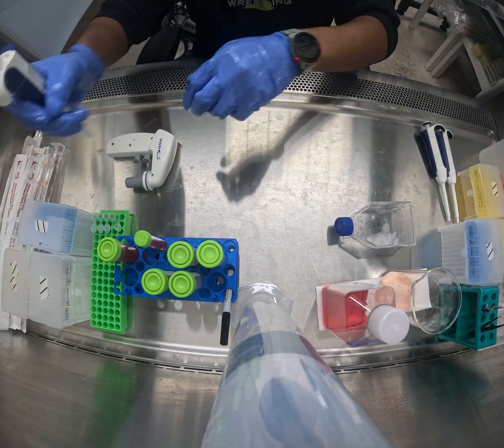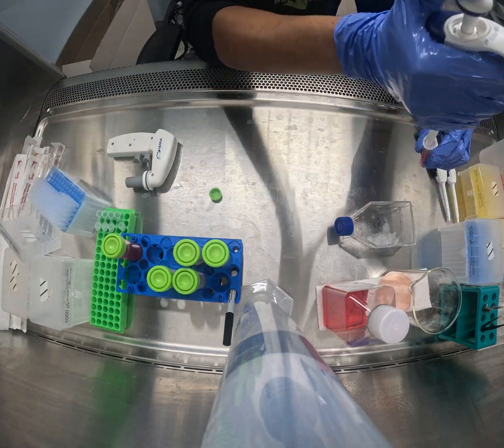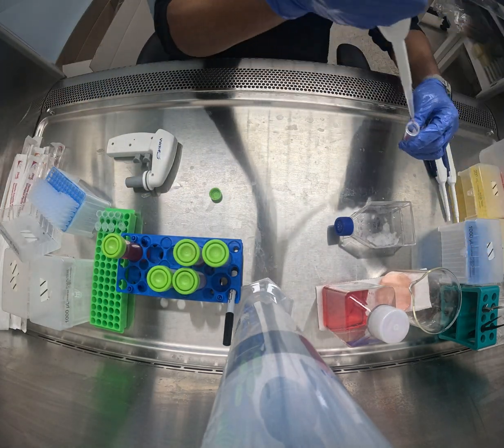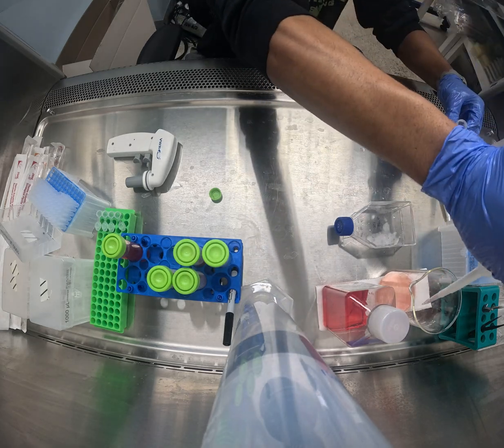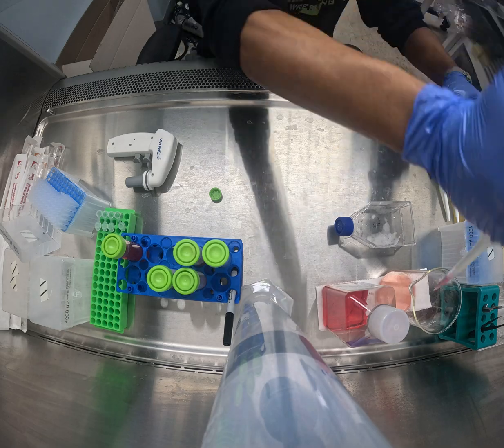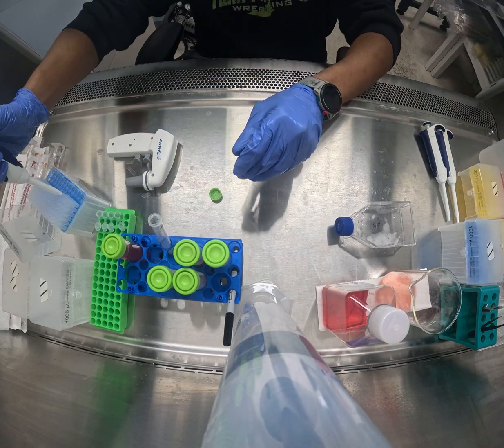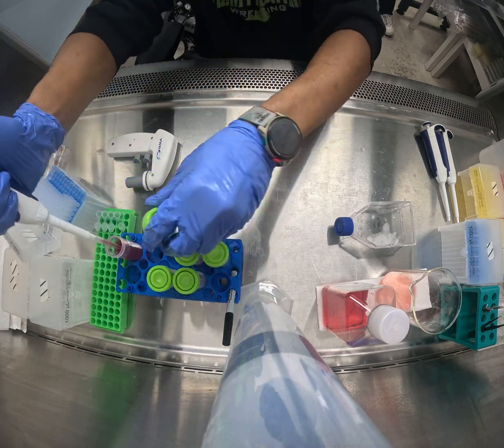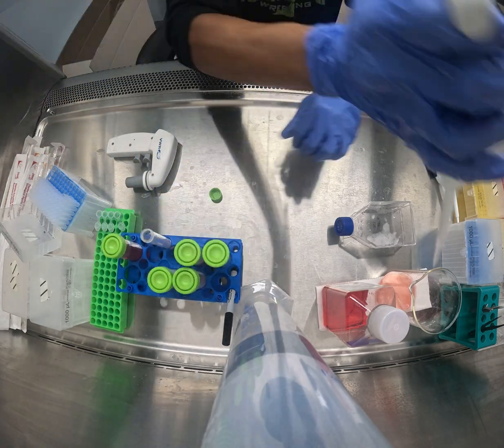Take this trypsin and medium solution that has your cells in it and transfer all of it into the 15 milliliter vial. Close the vial, take it to the centrifuge, and centrifuge for 5 minutes at 2000 RPM. After centrifuging, remove the excess medium and ensure that you do not disturb the pellet of cells at the bottom of the vial. Then take 1 milliliter of complete medium, add it to the pellet, and aspirate until the pellet is fully dispersed throughout.